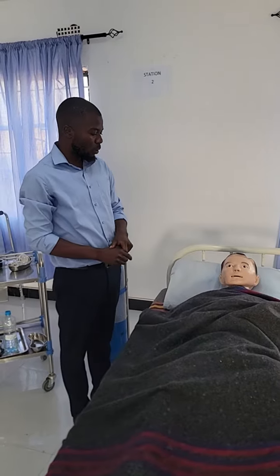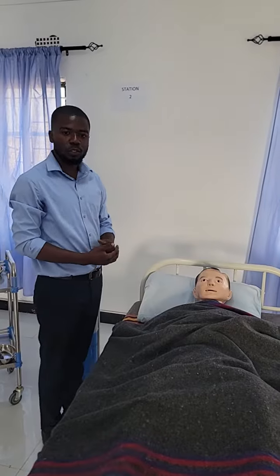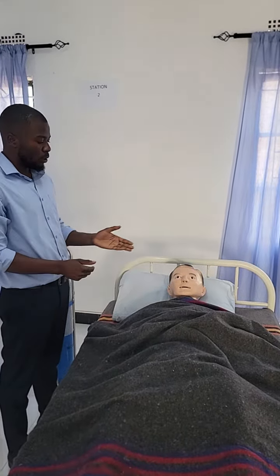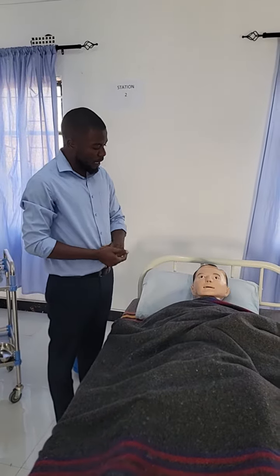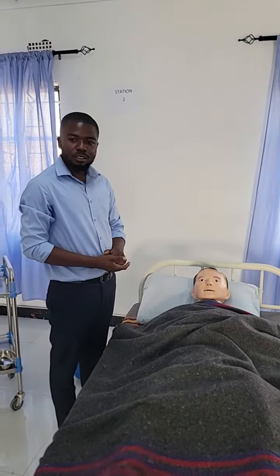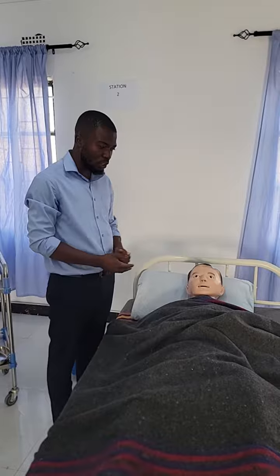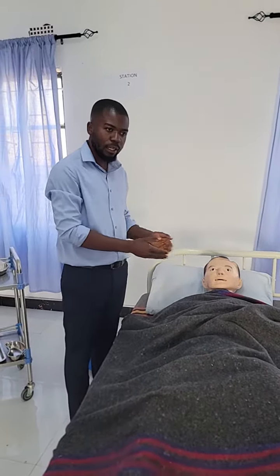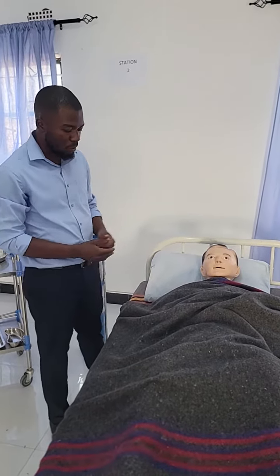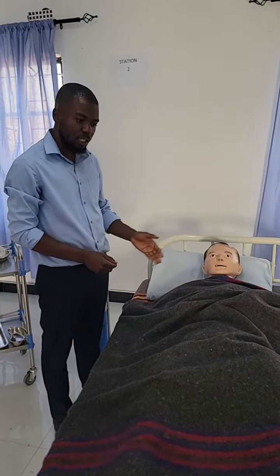You are going to introduce yourself, but before that, you greet the patient. You say good morning, or good afternoon, or good evening. Good morning, Mrs. Mumba. I'm student number 10 from Kushi College. I have been assigned to give you oxygen. Permission to go ahead, please. She has said okay. But before I begin the procedure, is there anything that I can do for you within here? She has said no.